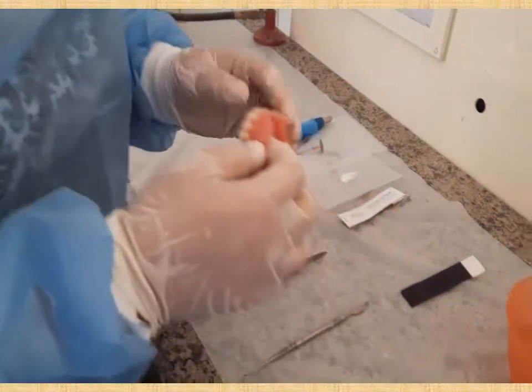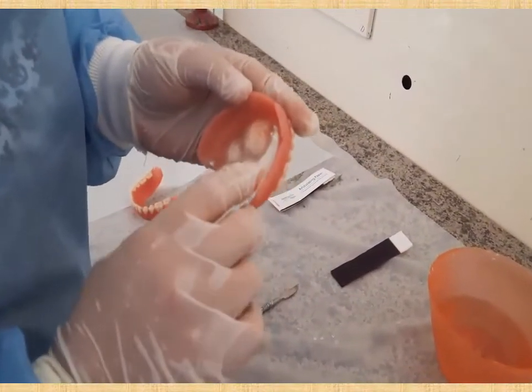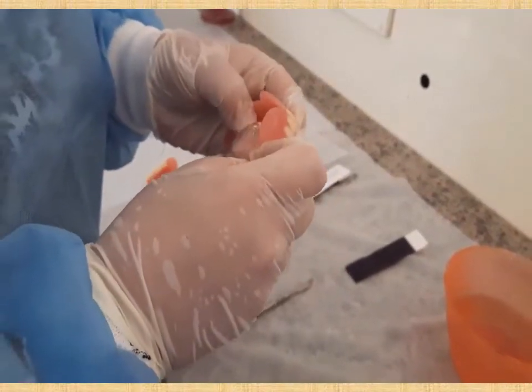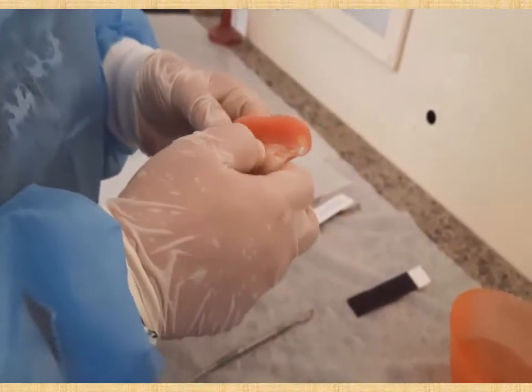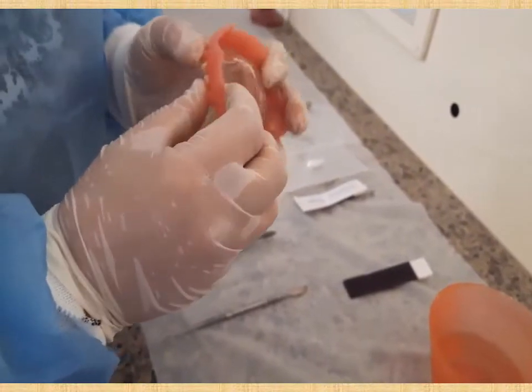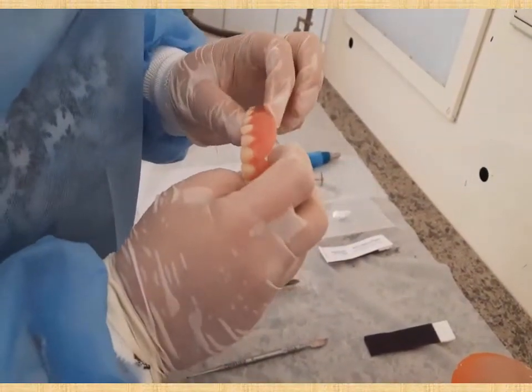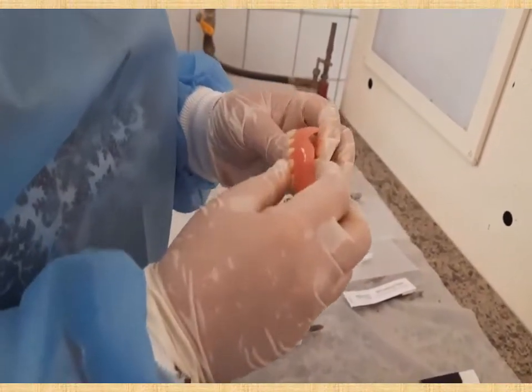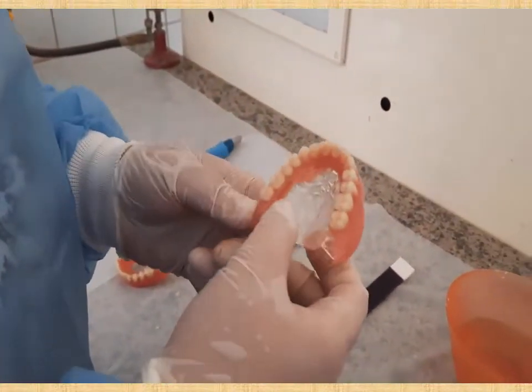First, check the upper denture alone. Check the fitting surface — it must be free from any irregular, sharp, or pressure areas that could cause problems, which will be checked using pressure-indicating paste inside the patient's mouth. Second, check the periphery and border: all borders must be well-finished, round, rolled, smooth, and all frenum spaces must be well-opened according to the anatomical structures recorded during the secondary impression stage. Finally, the polished surface must also be highly polished and finished with no porosity.